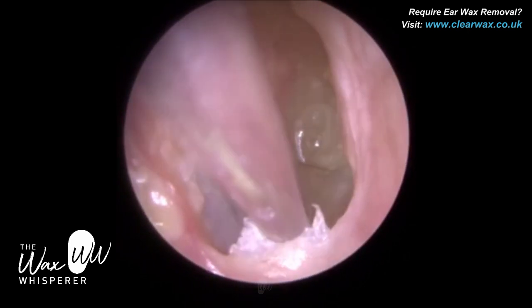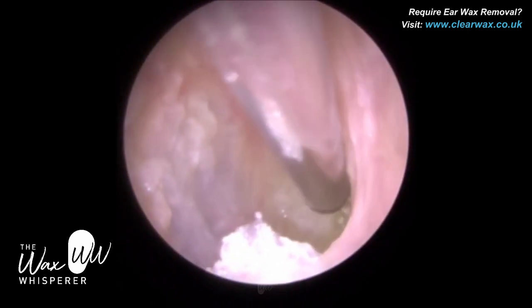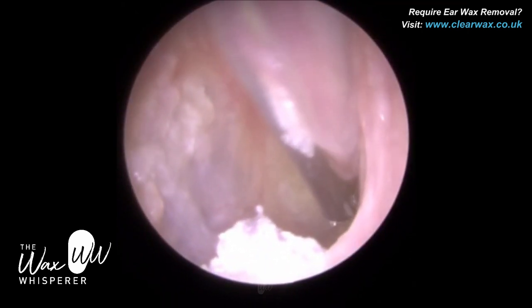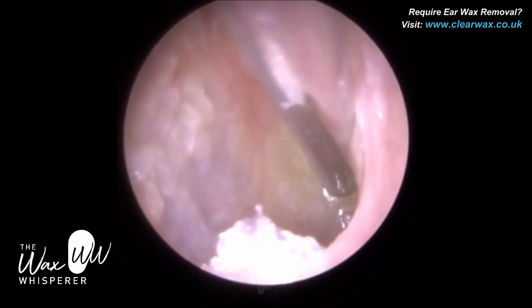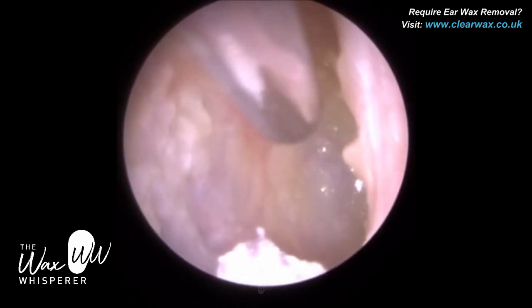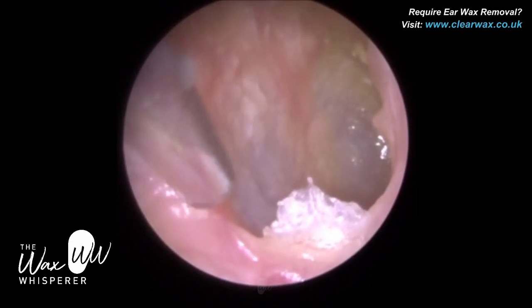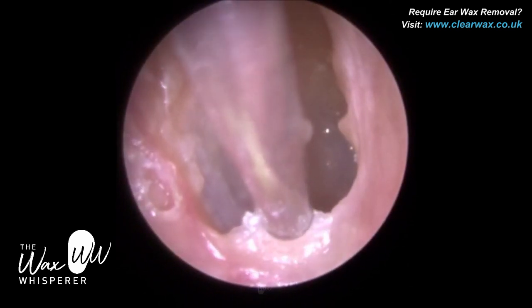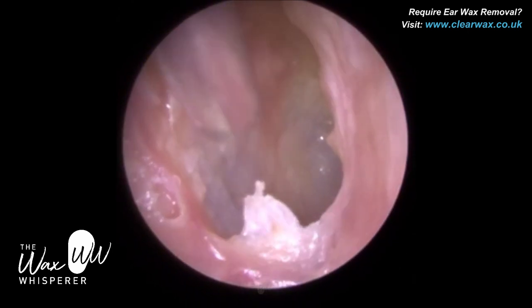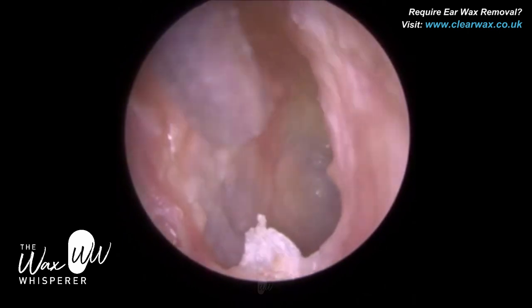Unfortunately, the patient is in a bit of a quagmire. They need to use the drops regularly to soften this dead keratin because of that crater — any dead skin that sheds and migrates will unfortunately collect there. The patient may undergo surgery; there have been discussions about patching the crater with a fatty layer to help natural skin migration. Unfortunately, getting an ENT appointment during the pandemic is very difficult. So what I'm trying to do is remove as much dead, infected skin as possible. Some of it is still really crusty and impossible to remove, so the patient will use more drops and return.